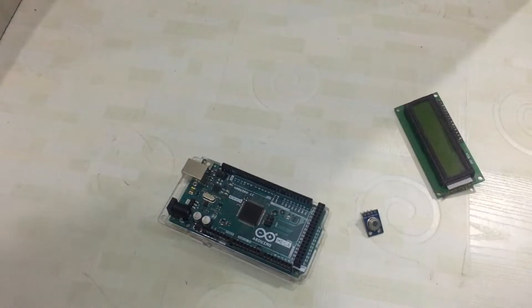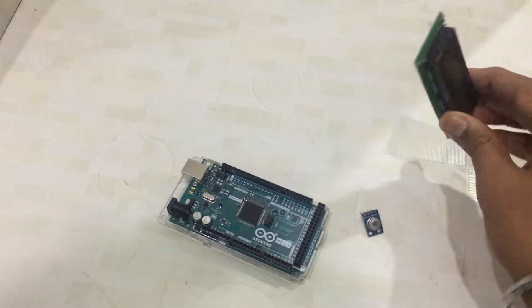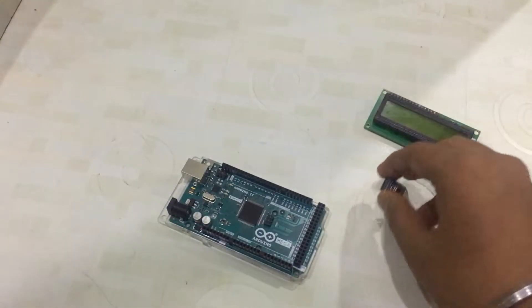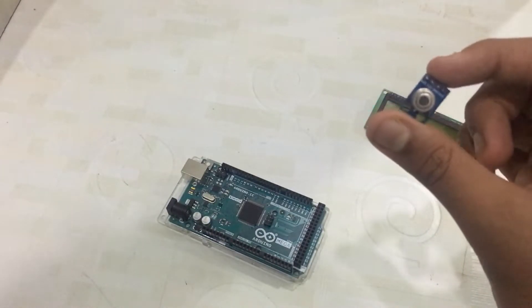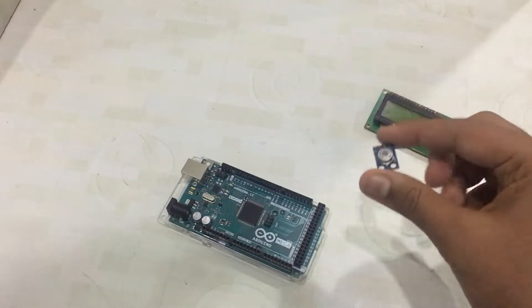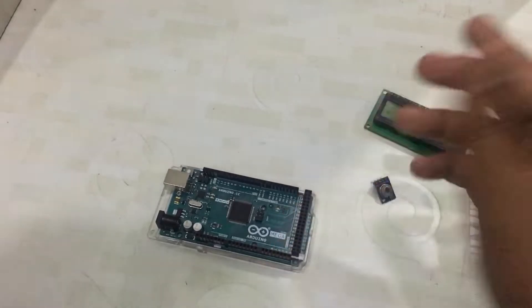So today we are going to make an infrared temperature gun so you can check in your house. Let's start making it. Things required for this project: a 16x2 LCD display, and the MLX90614 non-contact infrared temperature sensor, and an Arduino Mega.